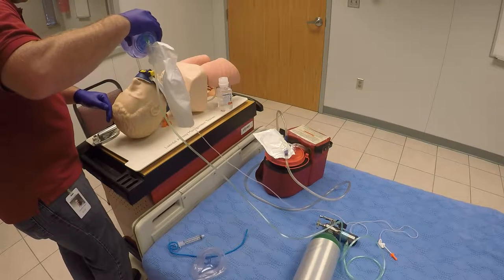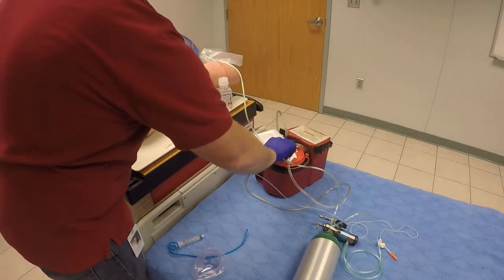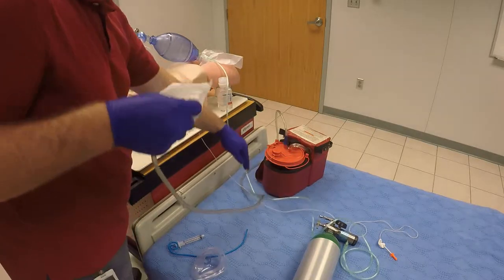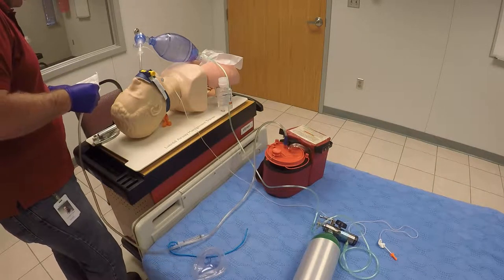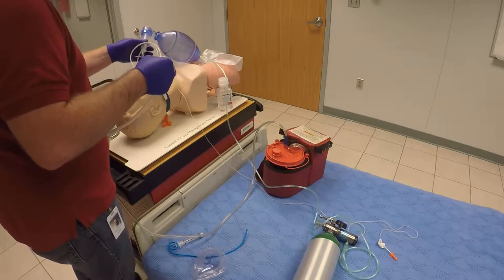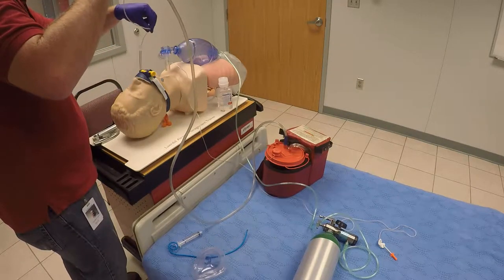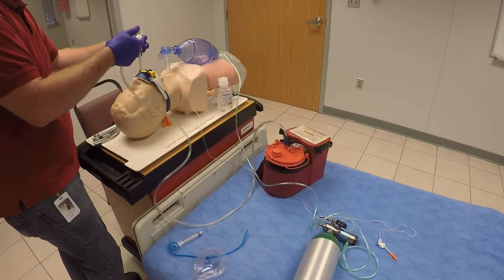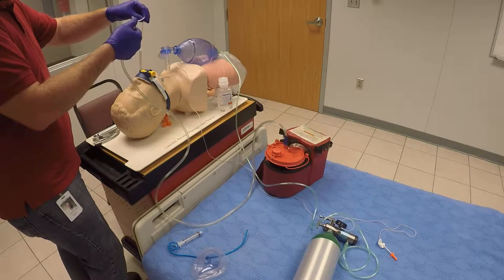If there is a need for suctioning, direct your partner to continue oxygenating as best they can. Get your suctioning device ready. Take a flexible suction catheter — make sure it's the proper size to go down inside the ET tube — and make sure your suctioning unit is properly assembled and working. You can lubricate it a little bit if necessary. Once your partner has pre-oxygenated, remove the BVM. Insert the suction catheter down the ET tube until resistance is felt or the patient starts to cough. Do not suction on the way in — only suction on the way out, covering the port, and take no longer than 10 seconds.